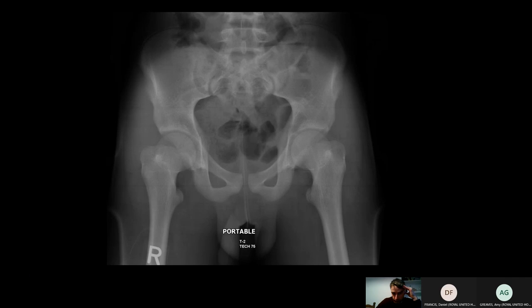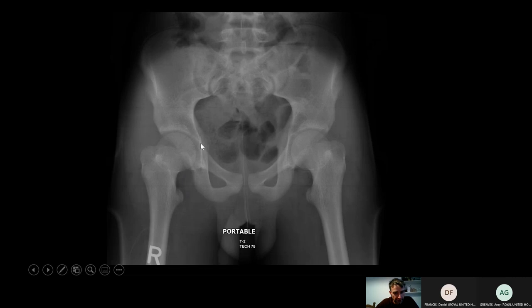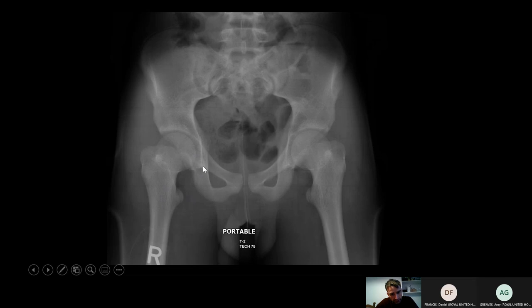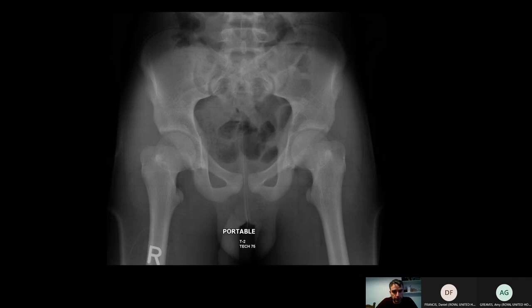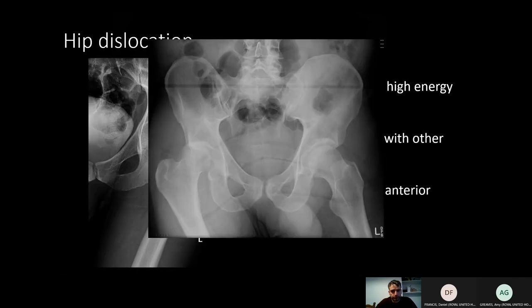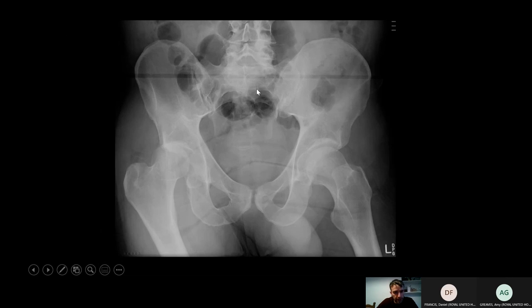Also be aware of acetabular fractures. Here both femurs appear quite externally rotated so you can't really see the neck, but if you trace the inside of the pelvic rim you can see a small step indicating an acetabular fracture. This will almost certainly need further evaluation, as it would dictate whether the patient can weight bear or not.